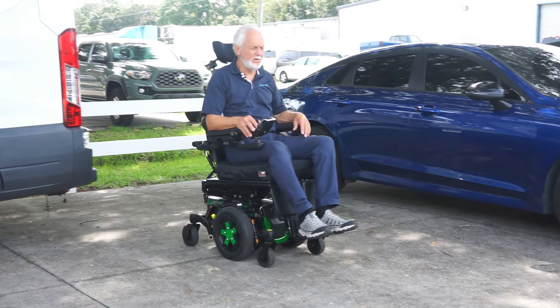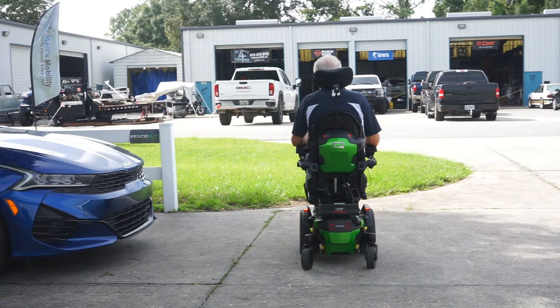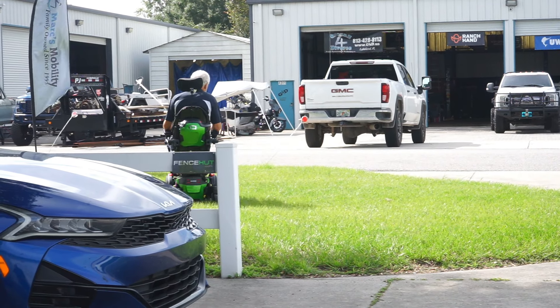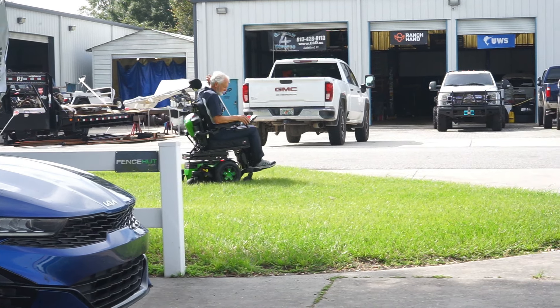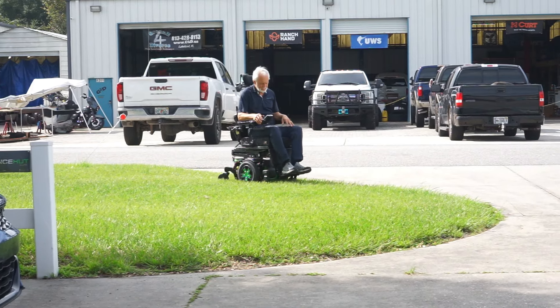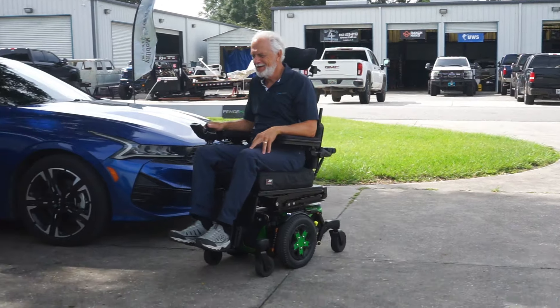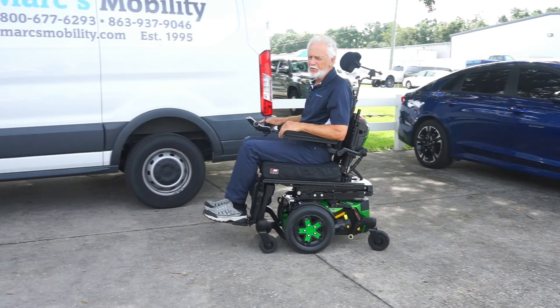We're going to go in the grass with it a little bit. These chairs have no problem in the grass.